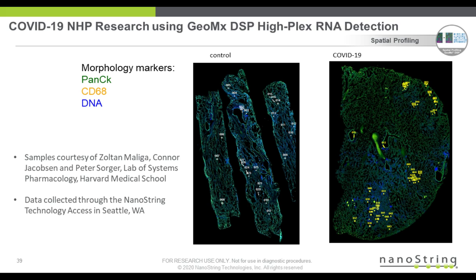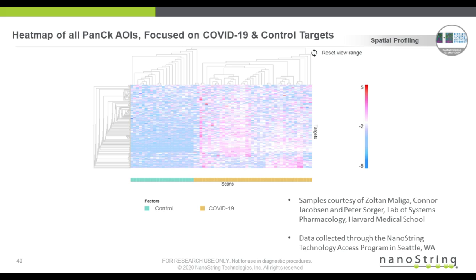This gives you an idea of some of the visualizations we're doing. This is work we do with Harvard Medical School. We're working hard on this, and this is a work in progress. But the Harvard Medical group allowed us to show you what this looks like pre-publication. This gives you an idea of the mRNAs that we're now spatially locating here. You can look on the left-hand side at the control region, and then on the right-hand side, at regions that are virus high and virus low.